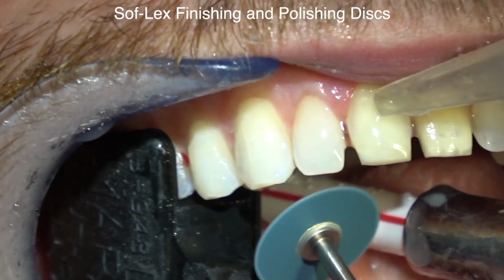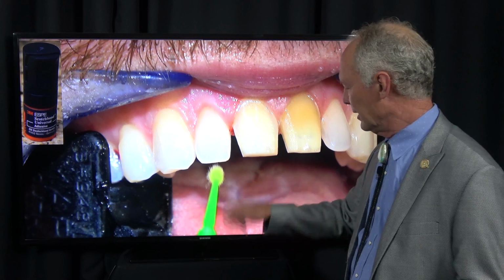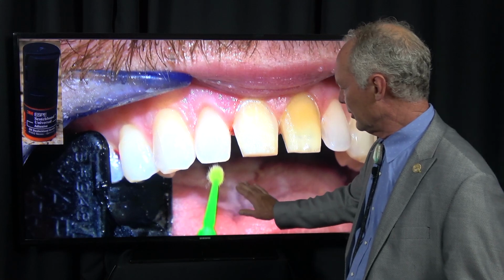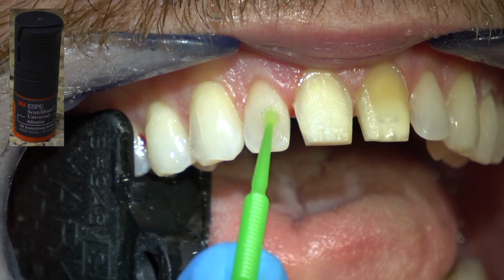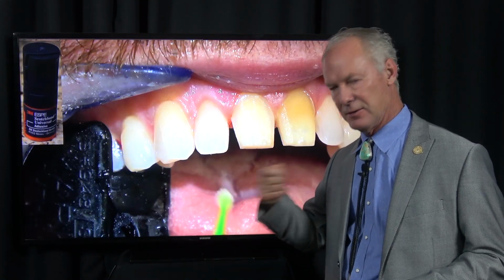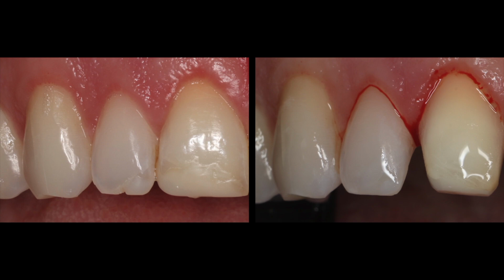A little more polishing. Once you've polished it, dip this pledget in the primer adhesive, and then dab it on the patient's bib or a 2x2 to make it almost dry, and then wipe that on the surface. You don't want a thickness, you just want to barely wet it as a glaze. So I've just barely dipped this in the primer adhesive, and then I touch it to the bib of the patient so that all but the tiniest little bit soaks off, and rub that on the composite and you get a nice sheen. That's the dental minute. These techniques work, and they work every time.